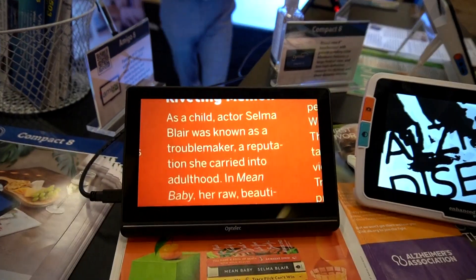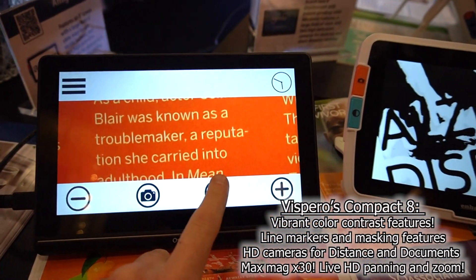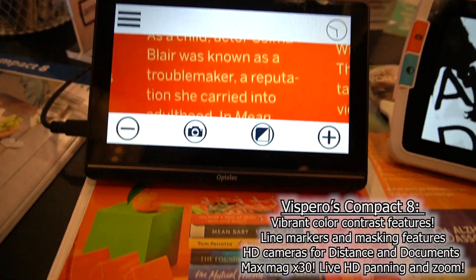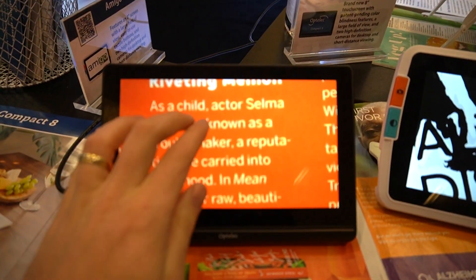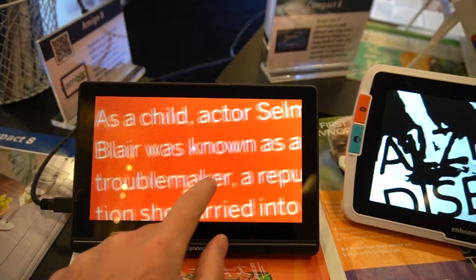Stopping here at the Vespero booth, looking specifically at the Compact Eight. This is an eight-inch fully touch screen, portable video magnifier with two standout features. First is dynamic contrast — with their new AI and algorithms, it makes it possible to read content that would otherwise wash out in high contrast mode. The other cool feature is live panning: when you are zoomed in, you're able to use the touch screen to pan around your material without having to move the actual device.